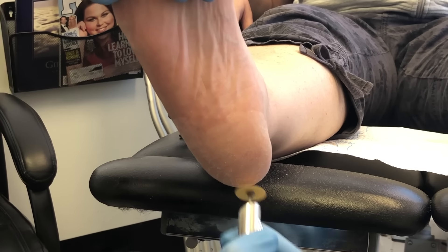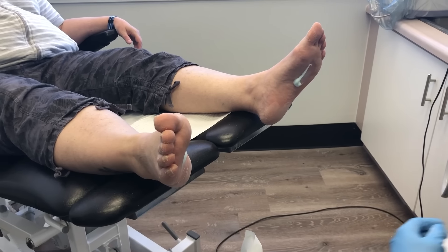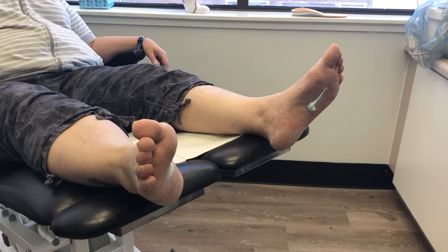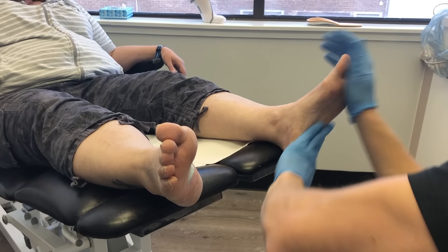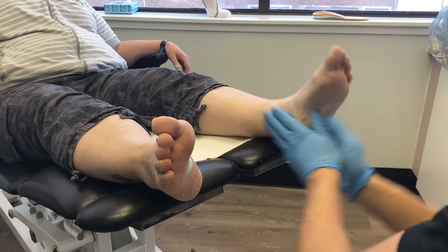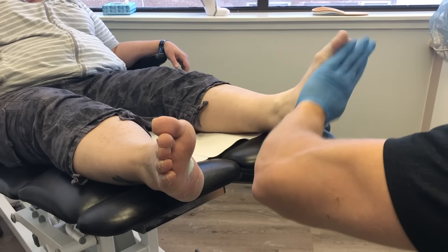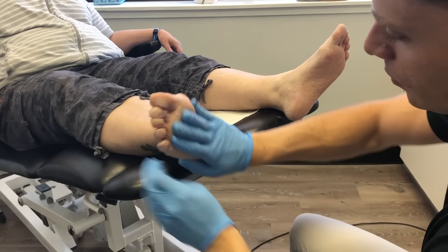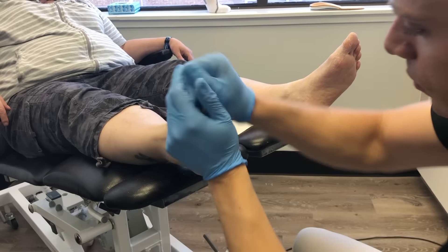One thing with the burr: you have to make sure you move fast. Don't keep it filed in the same spot or it will cause a burning sensation and can be uncomfortable for the patient. Here we're applying quite a bit of emollient because the patient has very dry feet. Since we've taken all that tissue down, it's a nice finish to give the patient so their skin is healthy when they leave. This patient would want to maintain it at least twice a day to keep that skin smooth and prevent it from drying out.